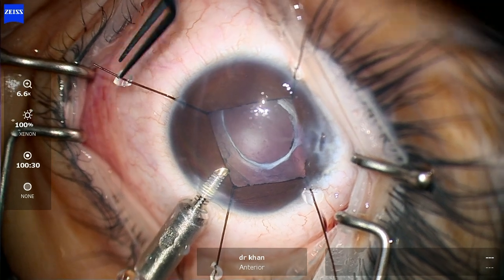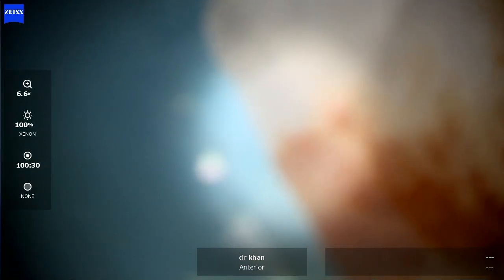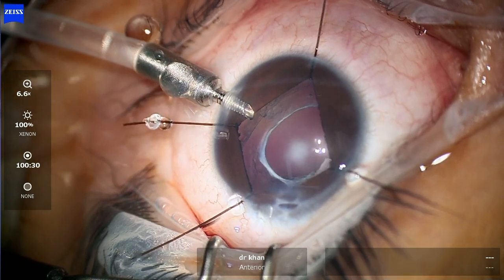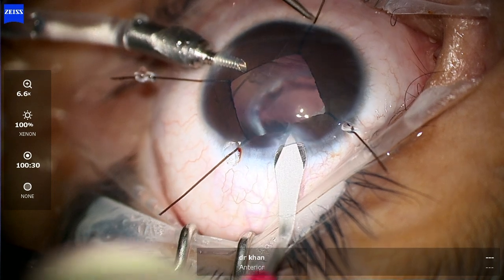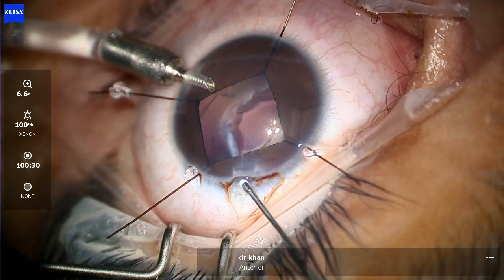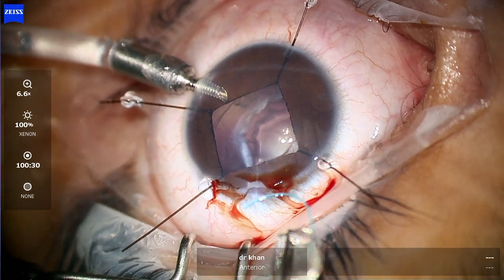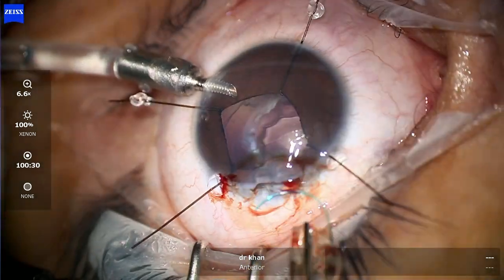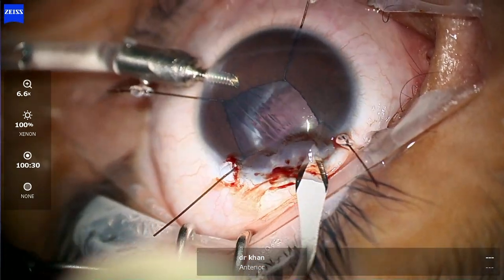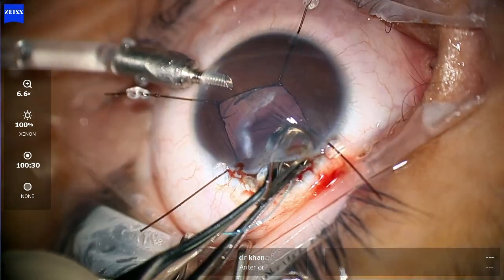Now just removing the iris hooks — we have a nice capsule bag here, it's completely clean. The advantage of doing this is that you will not end up in a donut situation after putting a lens. Usually if you do not do all these manoeuvres — I know it takes time — the lens ends up going forward, and in these cases they can end up with problems later on, especially with the iris keep on rubbing on the surface of the lens. Once the lens goes nicely inside the bag, the chances of all that are practically zero.